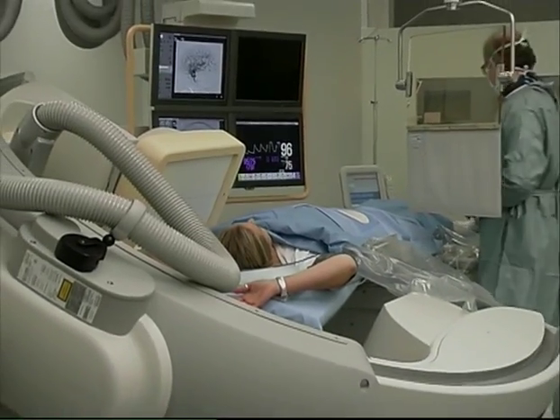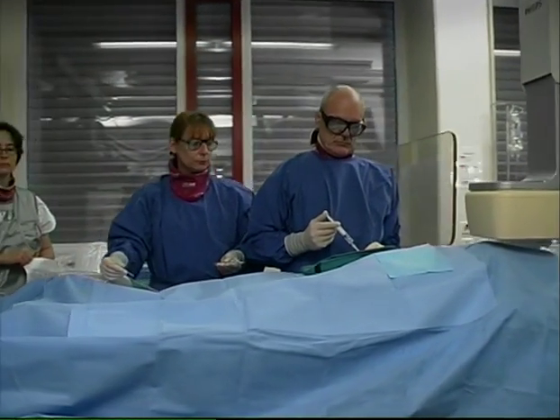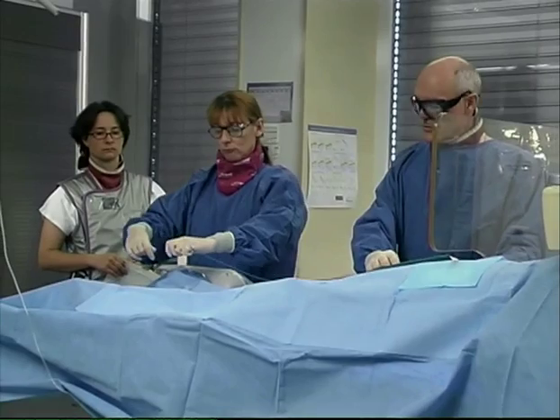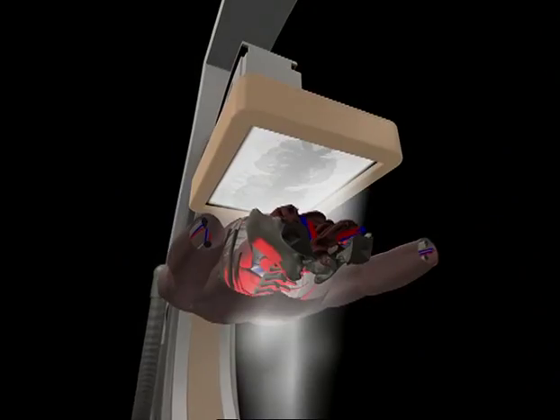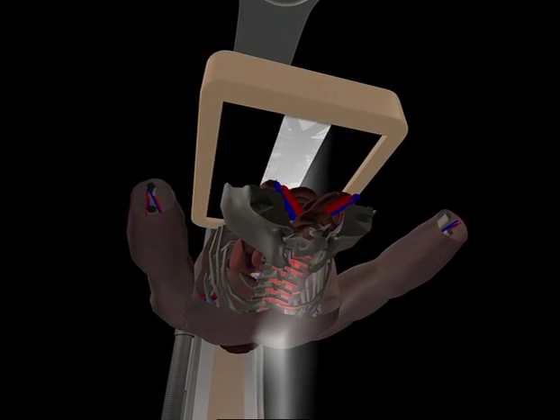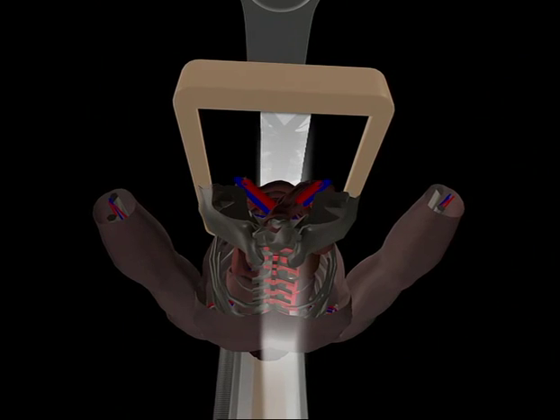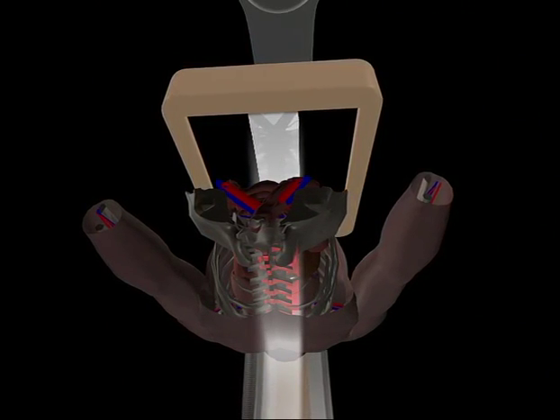X-ray systems for interventional radiology and cardiology feature extensive additional technical equipment to minimize scattered radiation exposure in attending medical personnel and radiation exposure in patients. The effective positioning is shown here. The smaller the body surface area radiated, the smaller the X-rayed volume. Patient organs are thereby protected and scattered radiation is reduced.